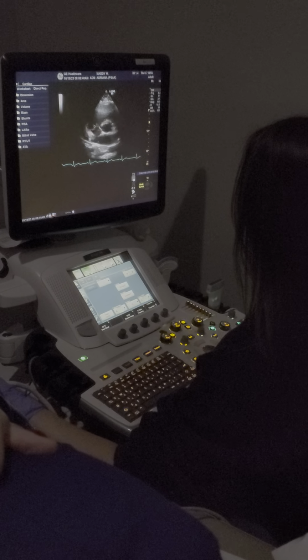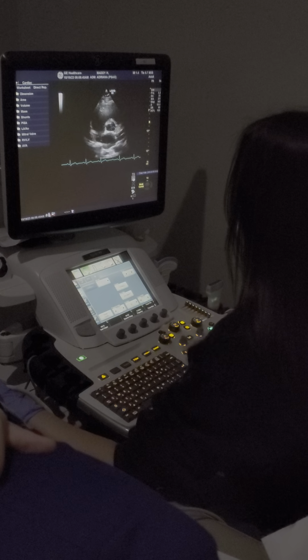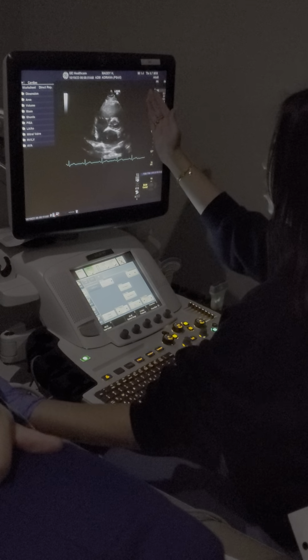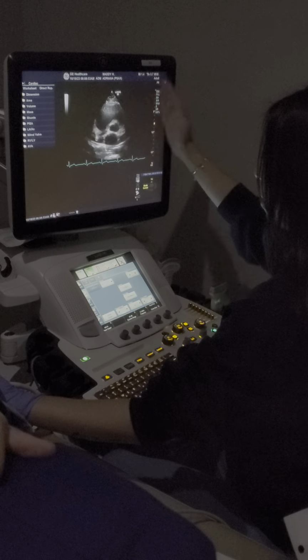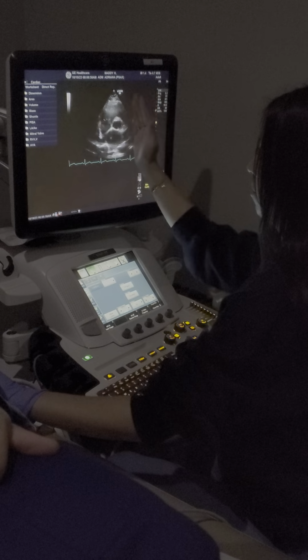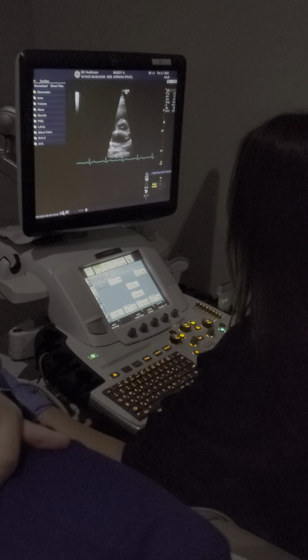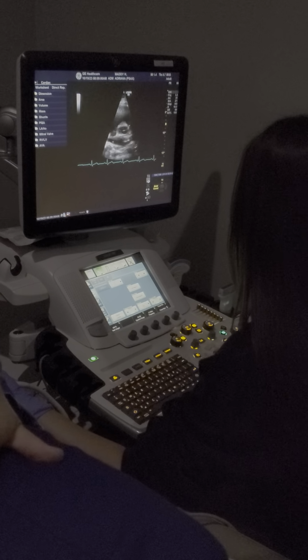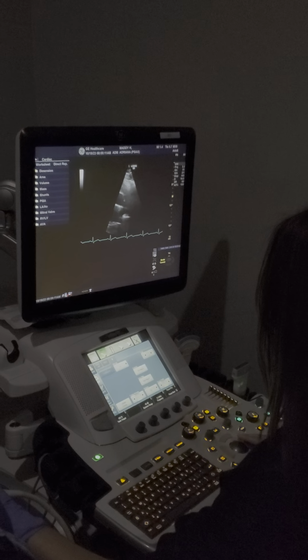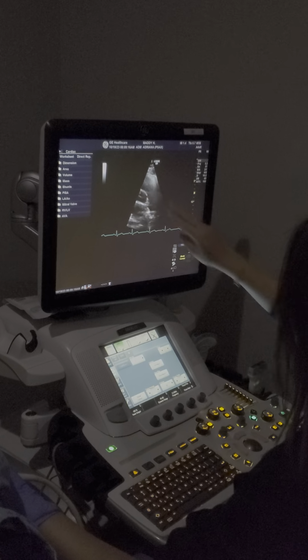Okay? What do you mostly use this for? Dopplers. I'll show you them. So you do your tricuspid, you do your pulmonic, that's the end of your lung, then you rotate into this. I start, and this is how you guys are going to do it as well, from right side over to this left side of the screen. I break it up valve by valve, okay? So I automatically will narrow my little sector, and then I will focus on my pulmonic valve. I moved up toward her head slightly, so I can bring that in really well.